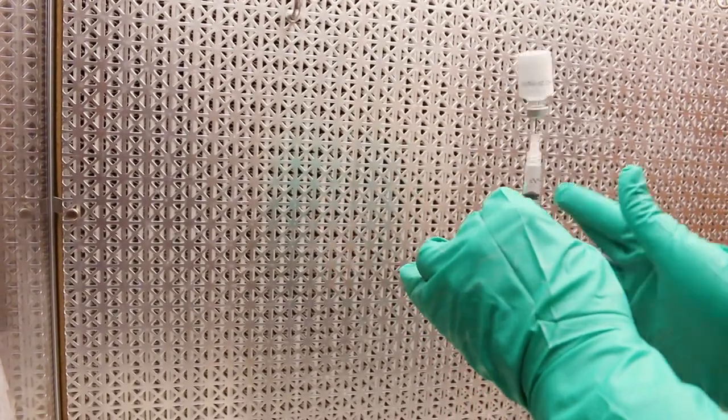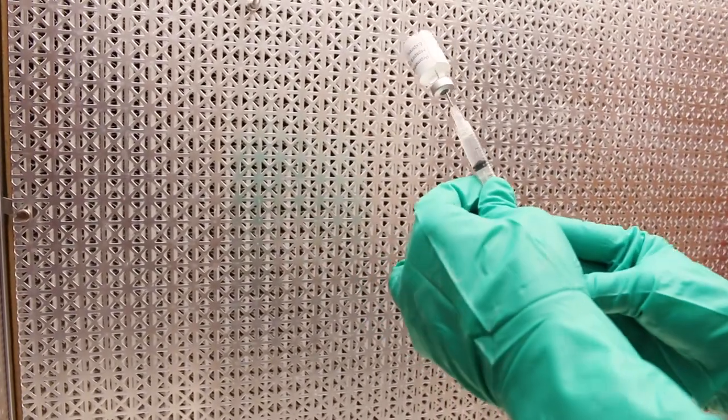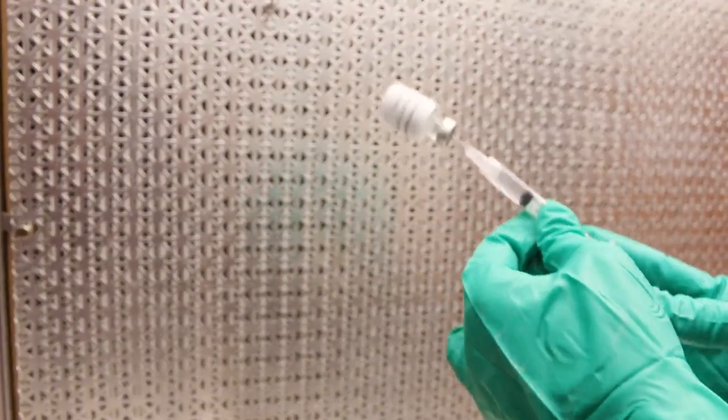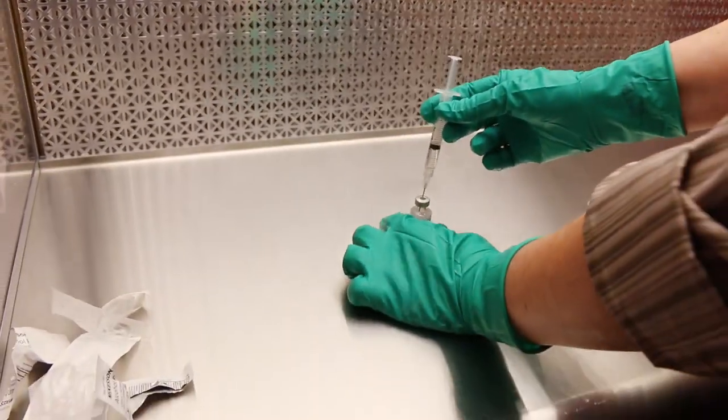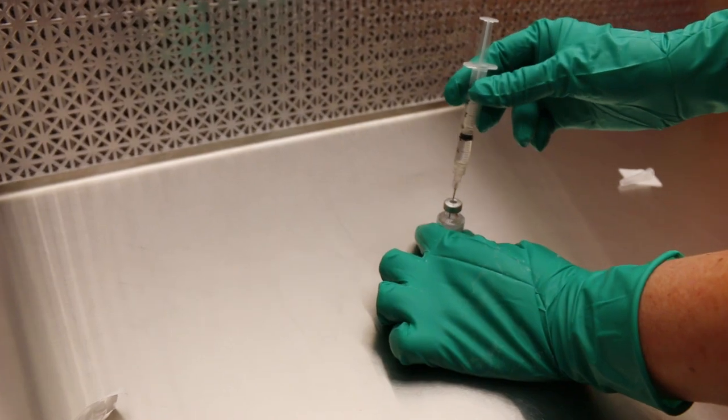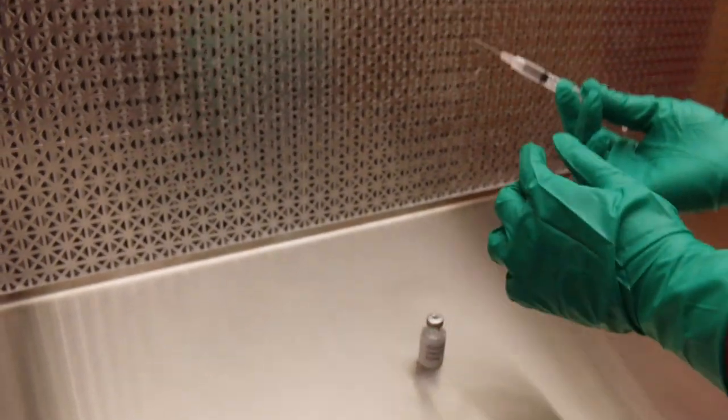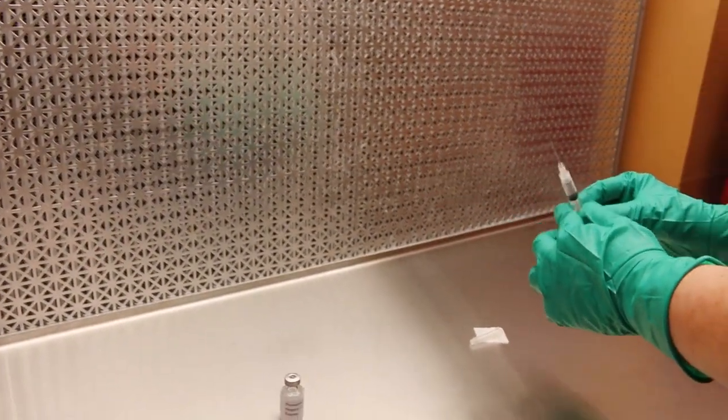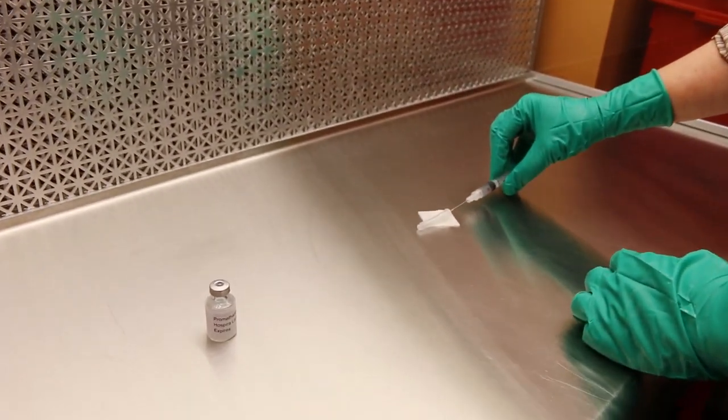Step twenty-two, return the vial with the syringe attached to the work surface using a counterclockwise motion and gently pull the syringe and needle from the vial. Step twenty-three, carefully recap the needle using the scoop method.